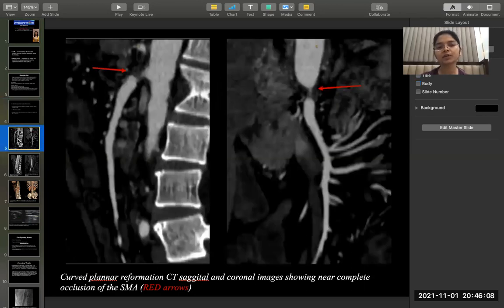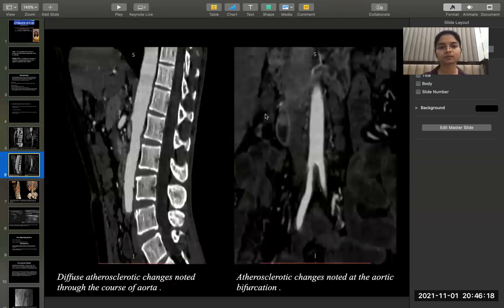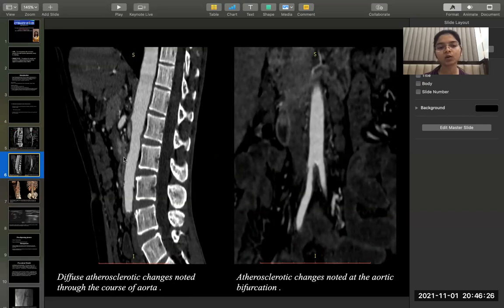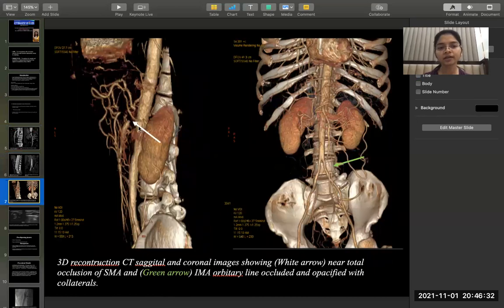This CT sagittal image shows presence of occlusion of the SMA at the ostium. The coronal image shows presence of 90% occlusion of the SMA. Another CT sagittal image shows diffuse atherosclerotic changes in the abdominal aorta along with occlusion of the SMA at the ostium. A 3D reconstructed image also shows a stenotic segment at the origin of the SMA.